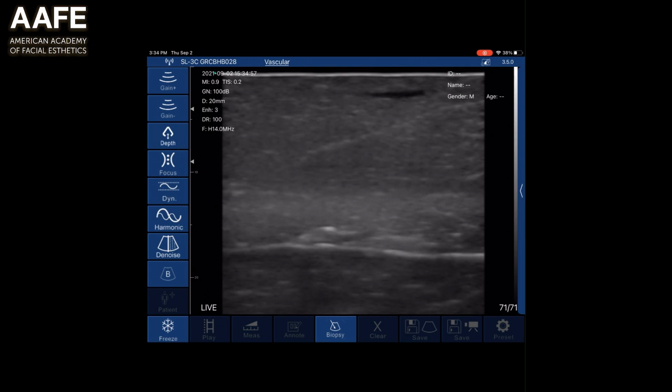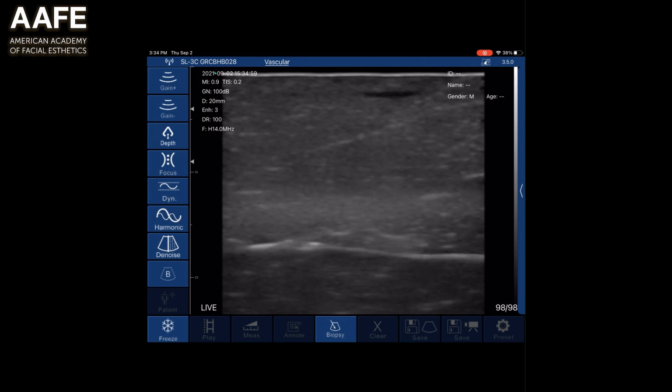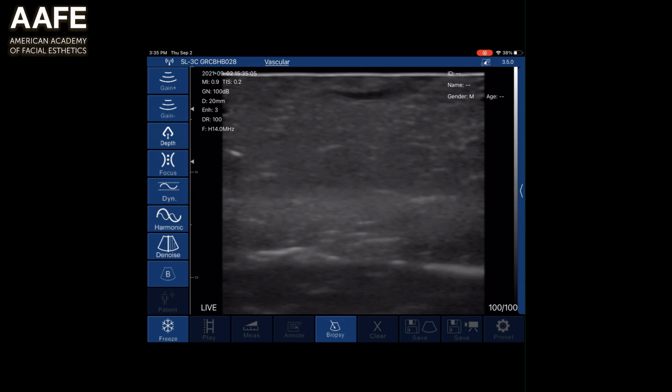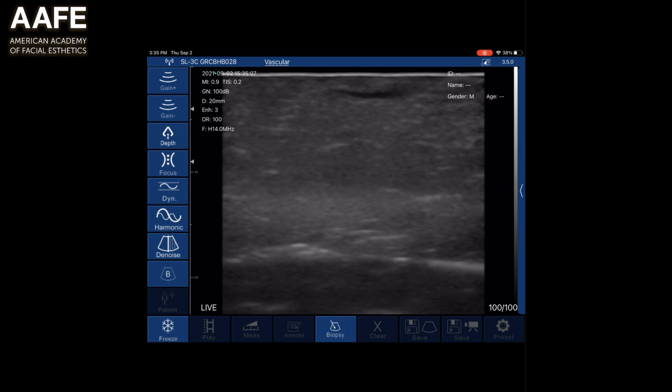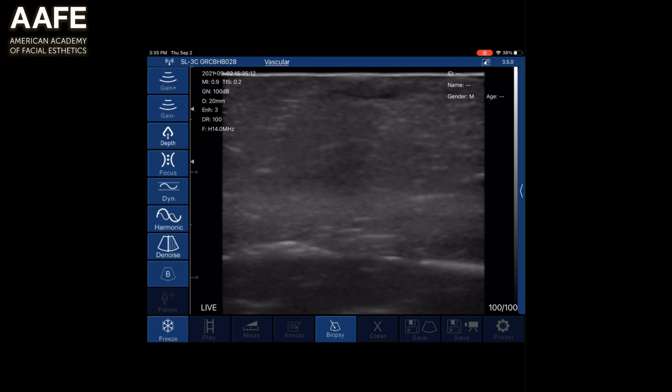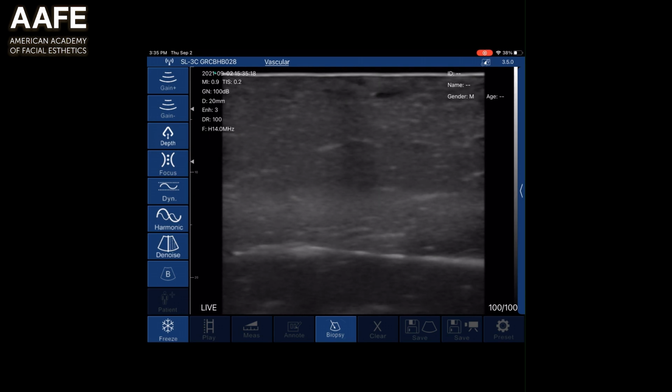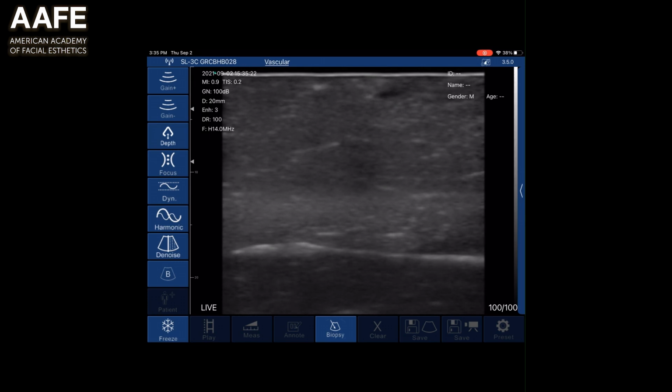And now we are going to use a different needle. We actually are using hyaluronidase in this sample here because we wanted to prove and show you what we can do with it. So you hold your ultrasound steady and then you get your hyaluronidase ready to go. And then you will go ahead and you will see that needle come in right in the middle of that filler. And then you place your hyaluronidase. That's what liquid looks like when you go ahead and place it in there, and make sure that you get it nice and covered here.